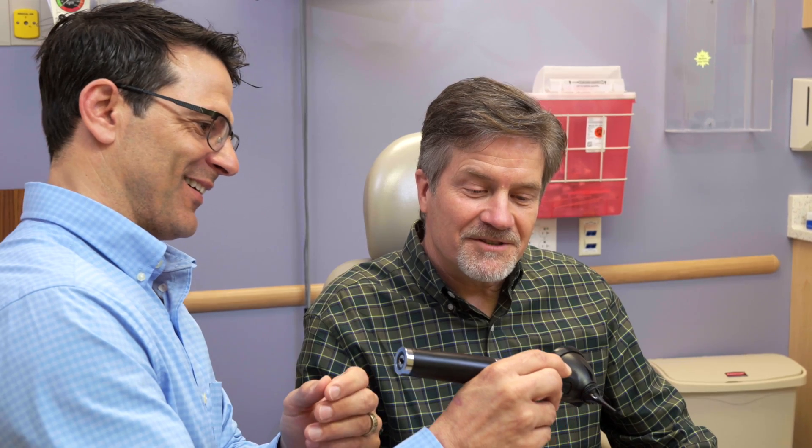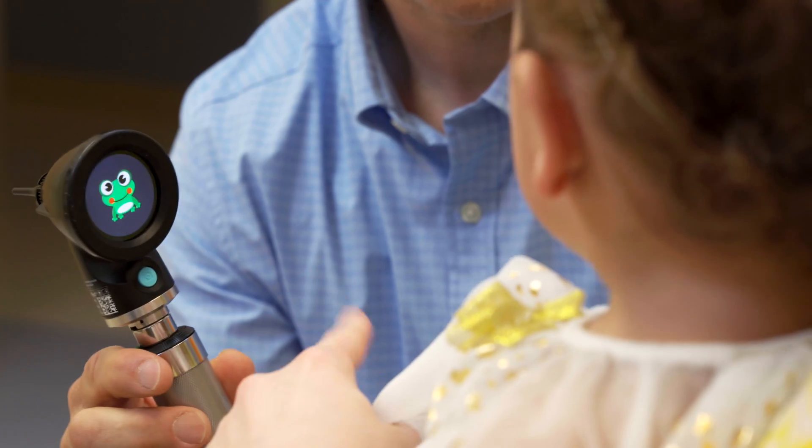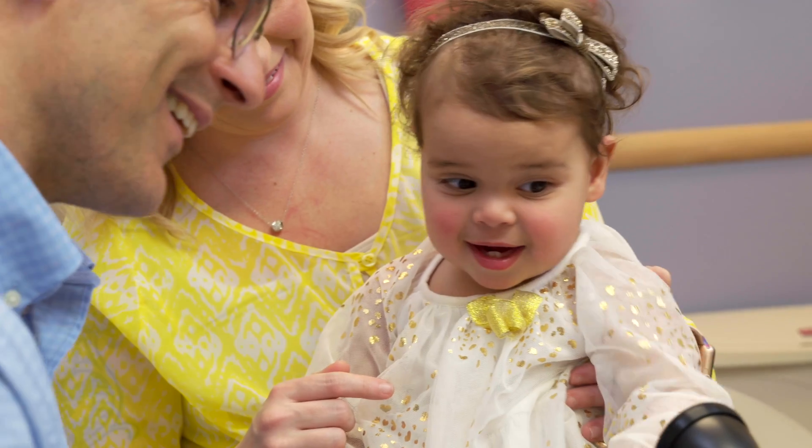Patients are amazed at seeing what their eardrums look like, and the little ones love the pediatric mode that will actually have them asking you to look in their ears again.